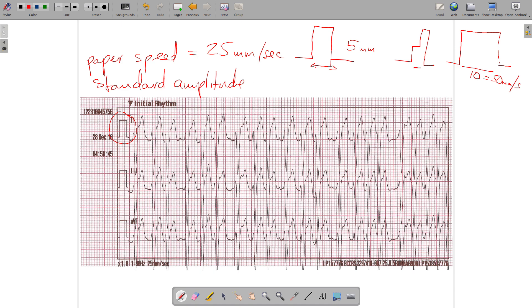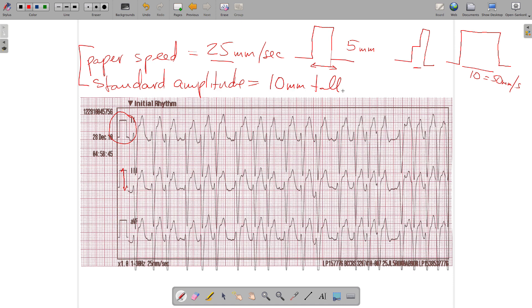The calibration spike also represents the amplitude standard. It should be exactly 10 millimeters tall. If it's not, that means the gain or amplitude standard has been changed, which requires changing the interpretation rules. So these two things are critical: at 25 millimeters per second, you must have a calibration spike that is 5 millimeters in duration and 10 millimeters tall, because 10 millimeters equals 1 millivolt of amplitude.